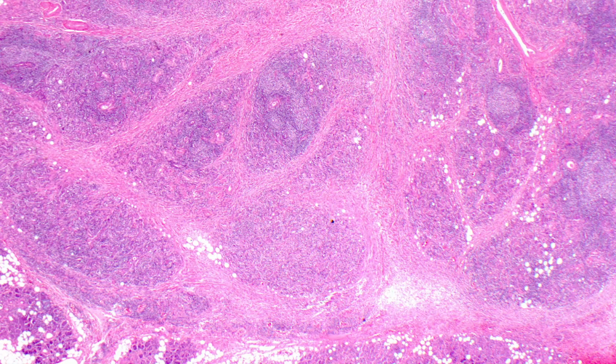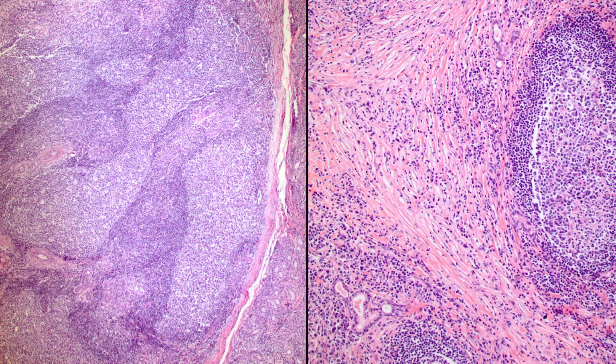And when you look at this on low power, remember, I'm not going to give you the diagnosis. In fact, I'm showing you 3 cases. Remember, one of them is IgG4 related disease, and the other 2 are mimics of IgG4 related disease. So here it is, and to me the most striking thing is this jigsaw puzzle-like appearance. Notice these pieces sort of fitting together. They're large germinal centers as well.